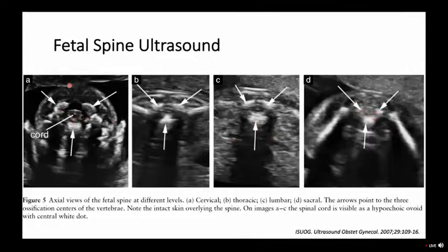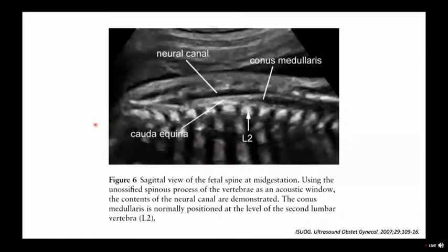I'll have you notice in these pictures that each of these is right up against the uterus or the placenta. Ideally, when you're looking at the spine in transverse, you have some fluid in between you and the baby, so that there is not this compressed thing, because it's very easy to miss an ONTD that maybe is compressed. You're not going to see it if the baby is up against the wall. And really, really nice if that kid's anterior, not flipped upside down. A posterior spine, really tricky to look at. So ideally, the kid's up facing you and the spine's towards you.